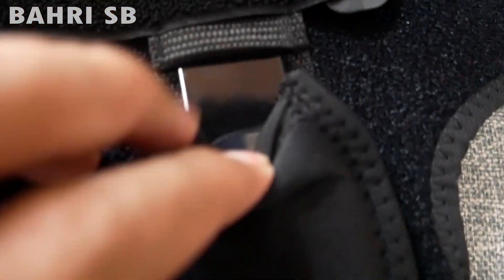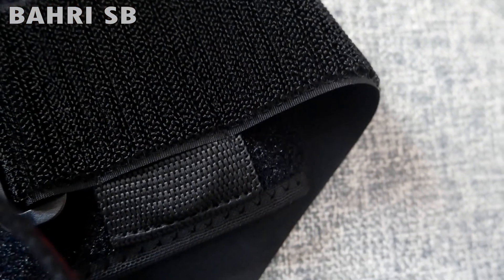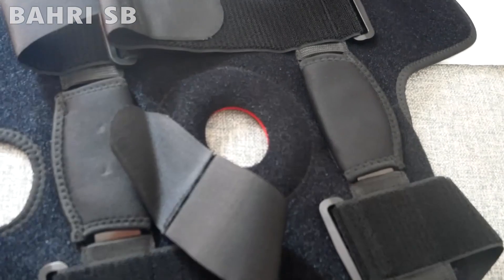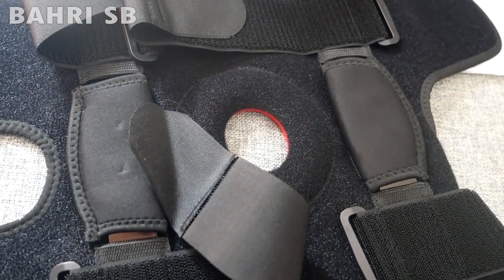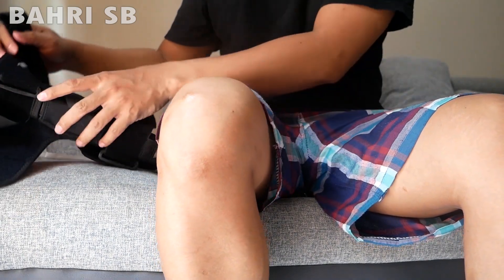Harganya saya beli di marketplace, satunya itu Rp130.000. Ukurannya ada M, L, dan XL. Di sini saya beli ukuran L, ukuran L dengan berat badan 45-75 kg. Kalau untuk XL itu dari 75-110 kg. Hanya terdapat 2 ukuran, L dan XL, yang M tidak ada.